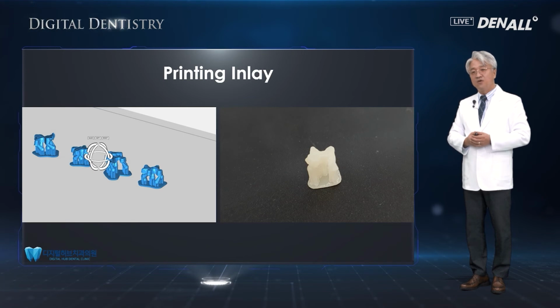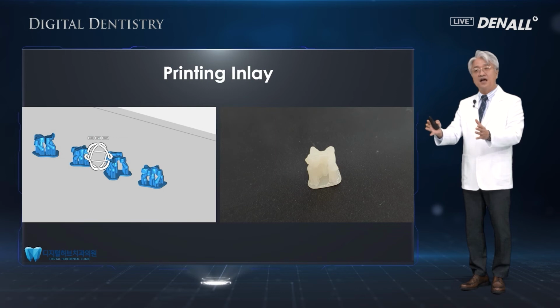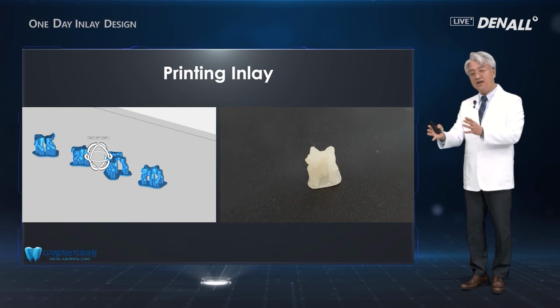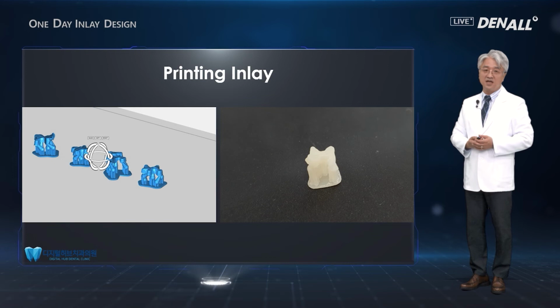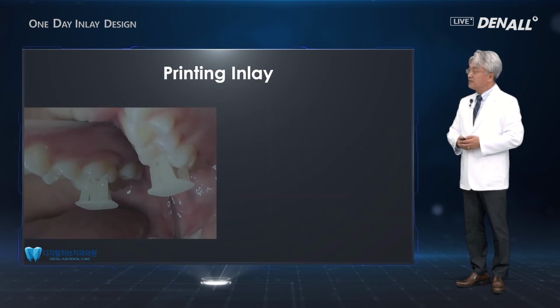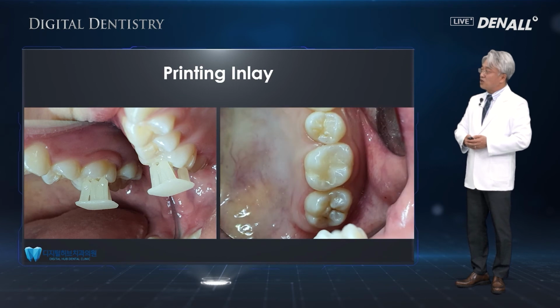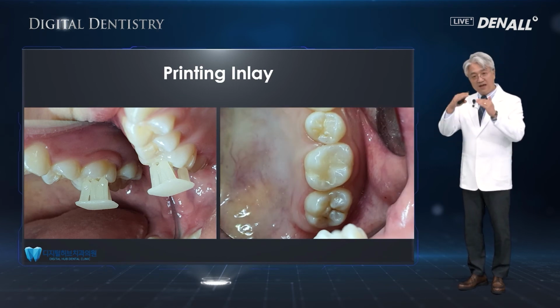So in making inlay with the one-day approach, if the patient needs to have many inlays, then one visit is sufficient to do all the work. So it's a very attractive option. So this is how inlays were made. And this is how it was delivered into the mouth.